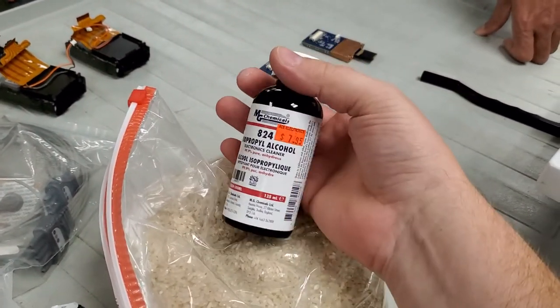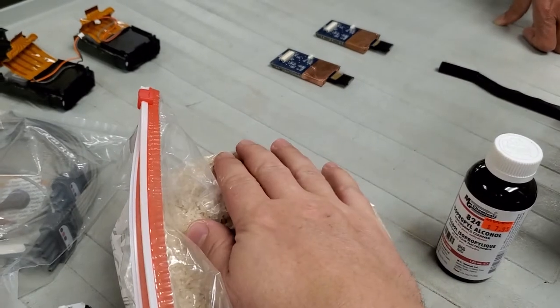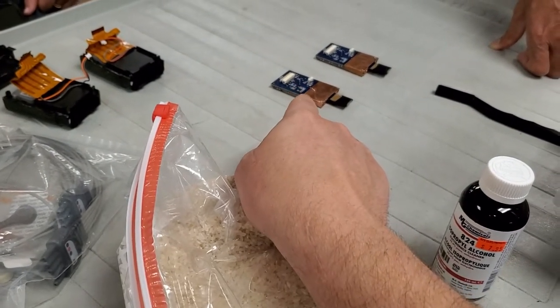The way to get the water out — you see here — I have 100% isopropyl alcohol. It absorbs water, so you douse the board heavily with it.